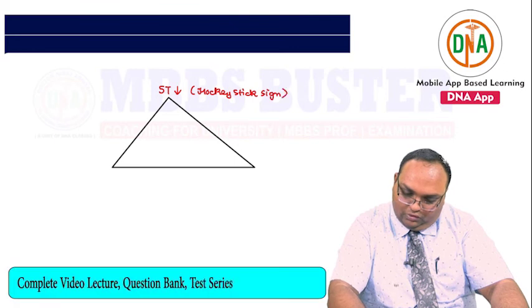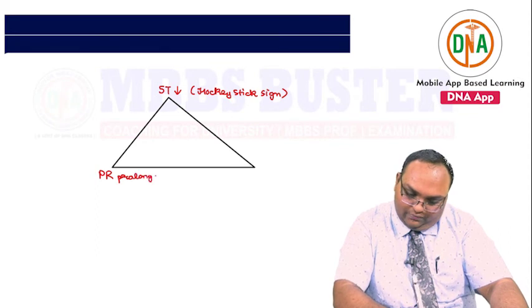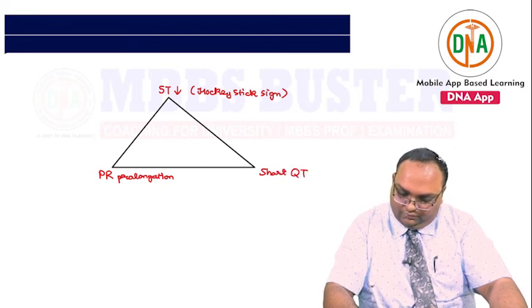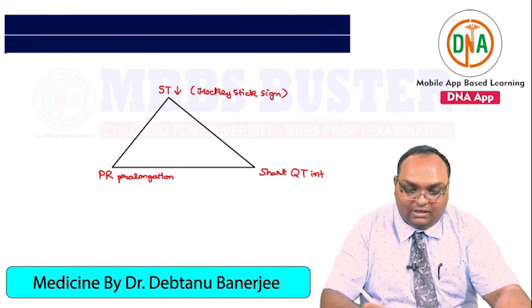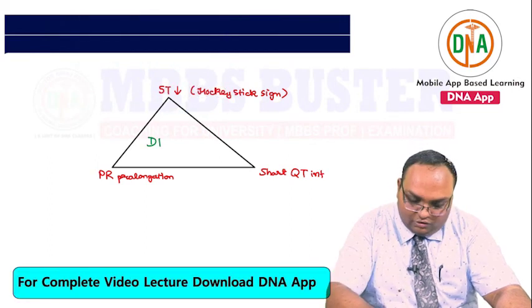We spoke about a PR interval prolongation, and we spoke about a short QT interval, right? The triad of these 3 electrocardiographic events is attributed to the use of a particular drug. I guess most of you know, digoxin.